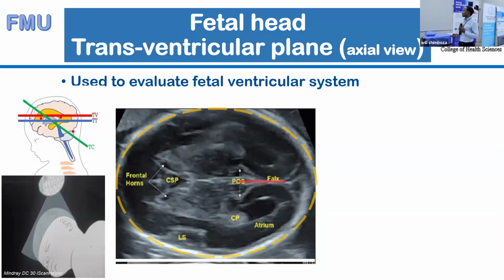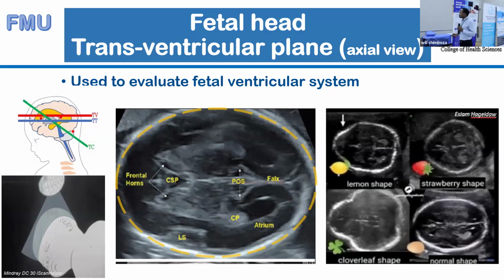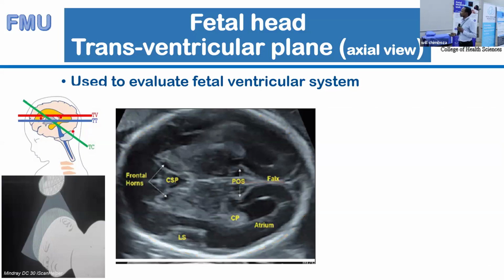So the skull bone should be continuously echogenic, with breaks only at the suture lines. If we do not see this continuous whiteness, or when we get to a point of clearly seeing the fetal brain, then we might begin to suspect that there is poor mineralization of the fetal skull, which we usually see in osteogenesis imperfecta. Then we move on to the internal structure.